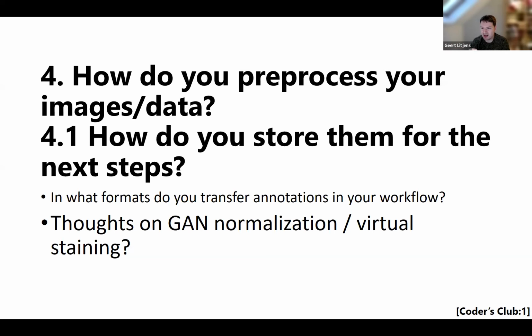Virtual staining, I am also a curmudgeon about. I think it's completely impossible to, for example, generate a CD8 stain out of a H&E stain, because there's no way you can get from morphology which are the cytotoxic T cells and which are the memory T cells, for example. I don't think that's possible. So that's a completely different discussion. But on the normalization front, I wouldn't say I'm a fan, but I think it has its use.